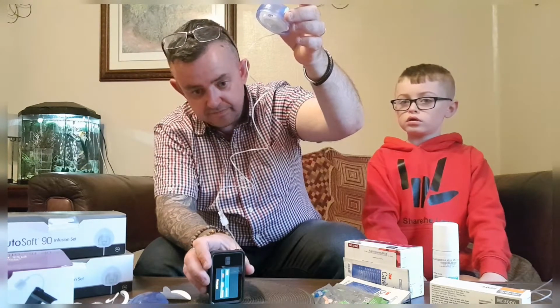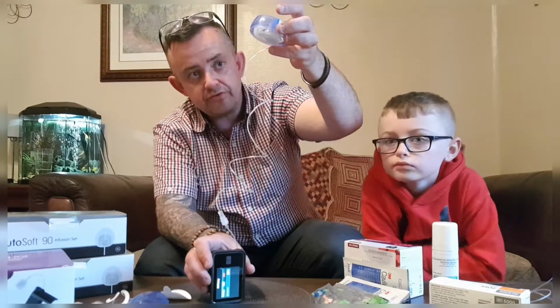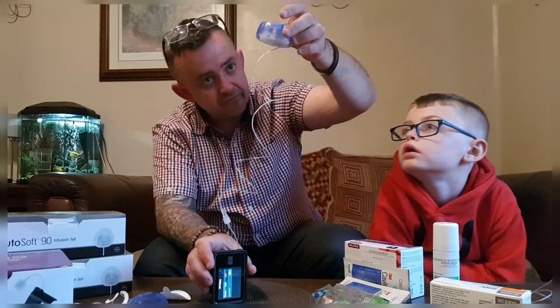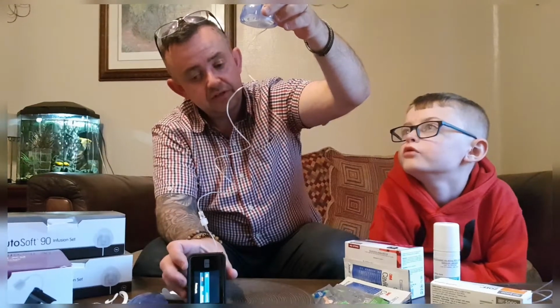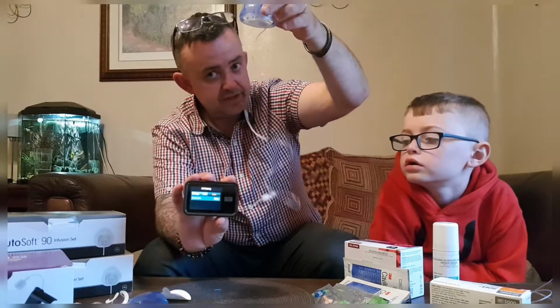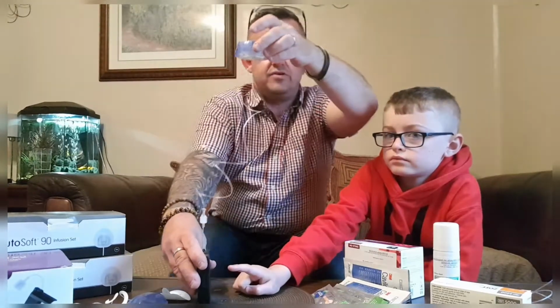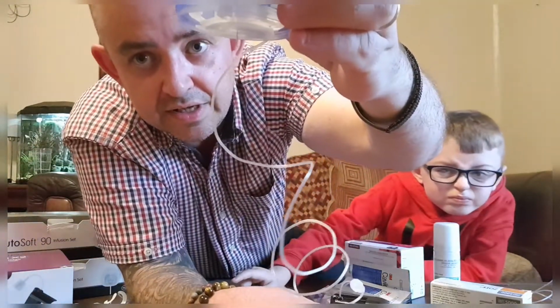I can't see it yet. But what we're looking for, where my little finger is, is three drops of insulin to come out of that hole where the needle is, and then we know that there's no air in the tube, because that's the important thing. We're on 7.6 units used. When I tell you to press stop, can you see that red stop word? When I tell you to press stop, will you press stop? Not yet though. Because when we get to three, I want to be able to show. There's one. There's two.